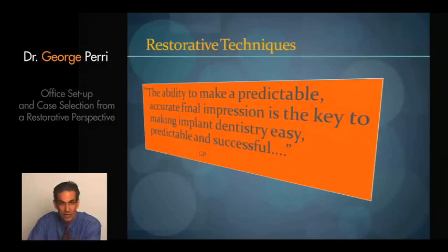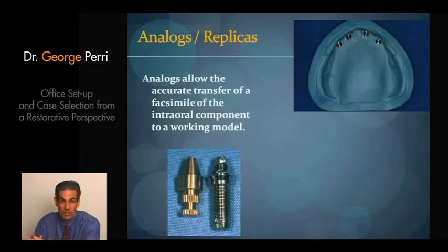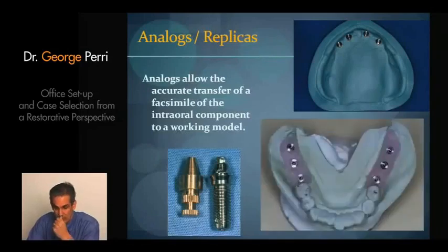predictable, and successful. There's no reason to make it hard, but sometimes making it too simple makes it much harder, and that's not our goal. The first terminology, and really understanding implants, is also the ability to learn a new language, of the components that we need to utilize. And there are different terms that are thrown about. One is an analog, one is a replica. Whatever we're taking the impression of intraorally, we need an analog of that component, a replica of that component, so we can achieve our master model.